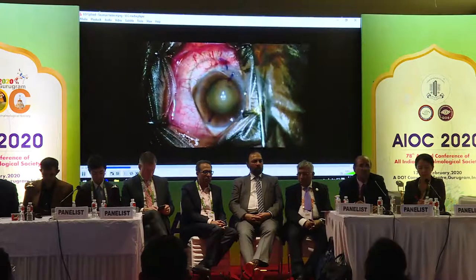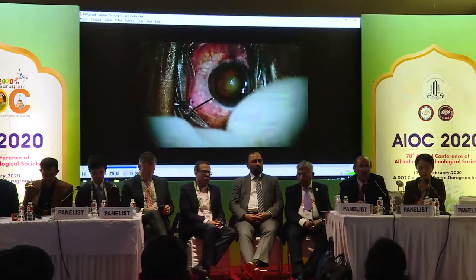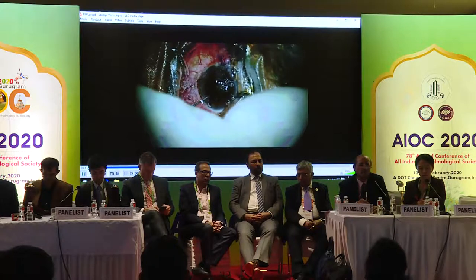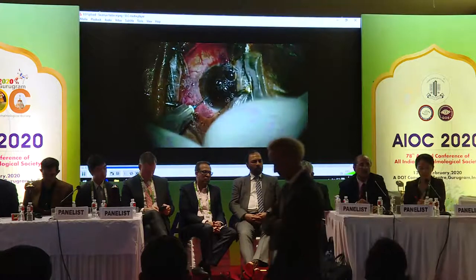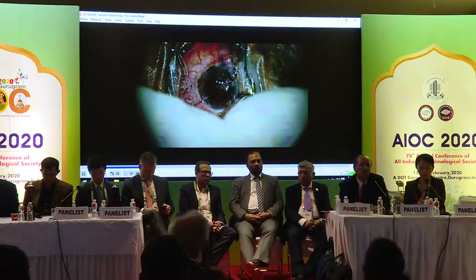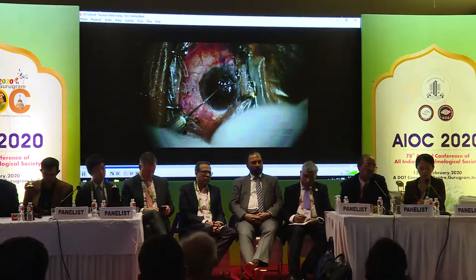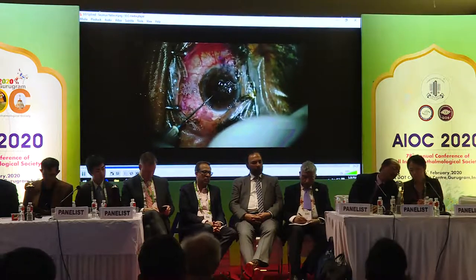After the initial marking of axes for toric IOL implantation, two scleral entries were made. A cohesive viscoelastic was injected into the anterior chamber using a 27-gauge cannula. As can be seen during injection, the viscoelastic cannula distorted suddenly and directly hit the lens, causing 360-degree zonulodialysis and lens subluxation.